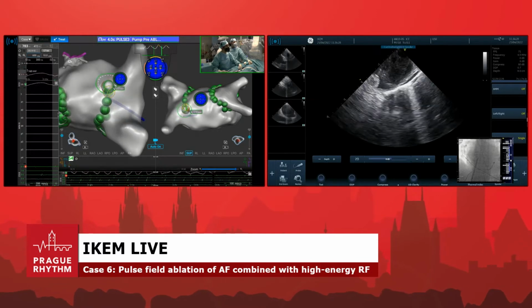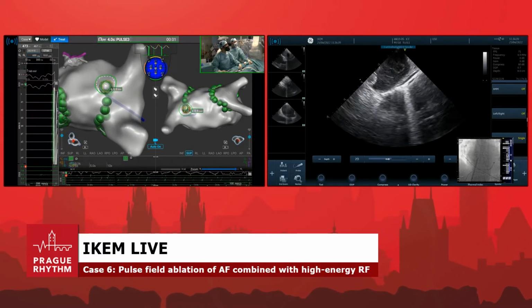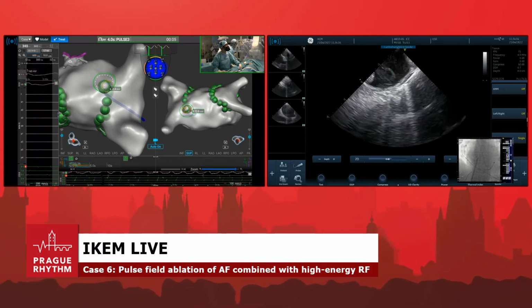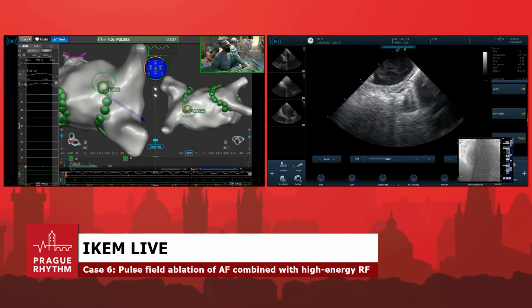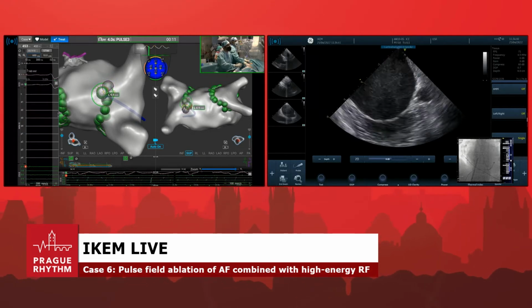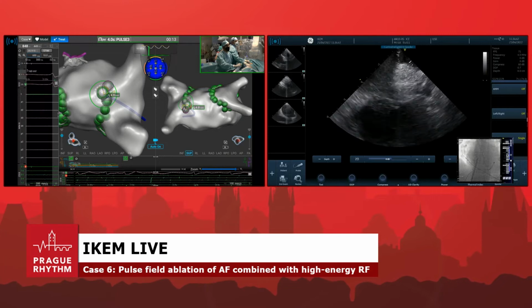We have a VF. What is this? We have a VF. Can we shock? Guys, show us for a second. It's a VF. There's a VF. Hey, stop. Stop. That was an arrhythmia.